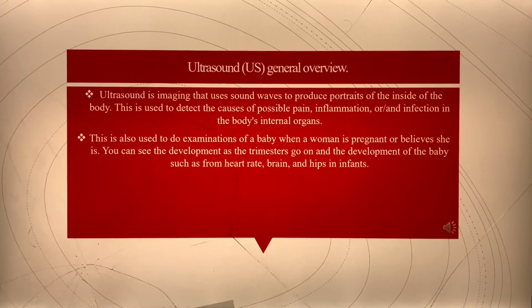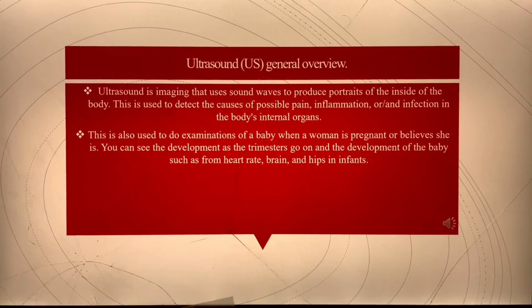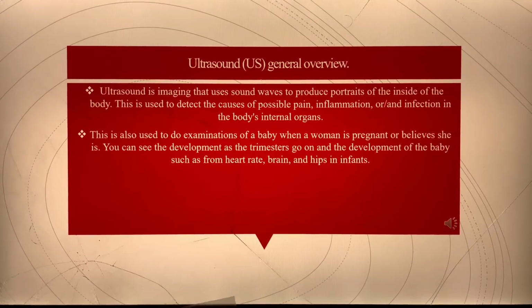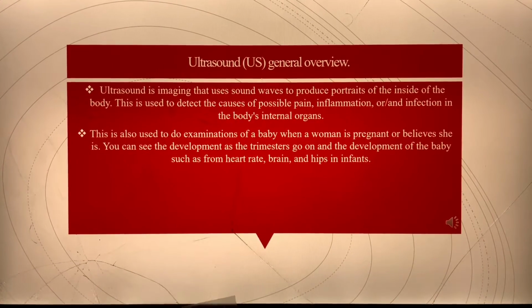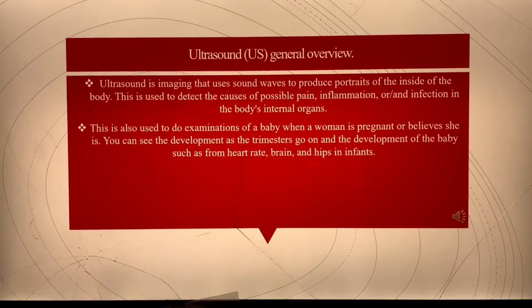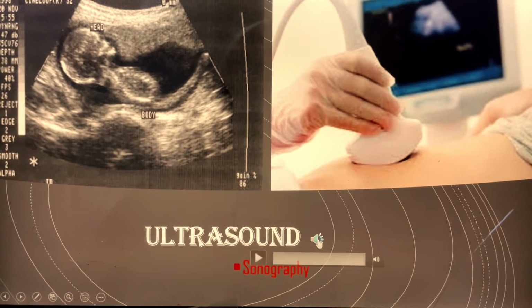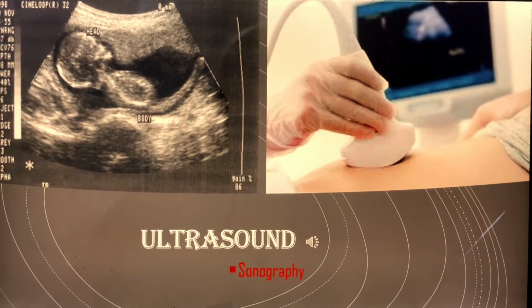So ultrasound is one of the modalities that has really, with technology, grown a lot, and it's another modality that you can see things that can't be seen with the visible eye. You're able to see it, and it's really detailed. It just works with sound waves, compared to like X-ray or CT or anything like that. So here is an example of ultrasound, also known as sonograph.